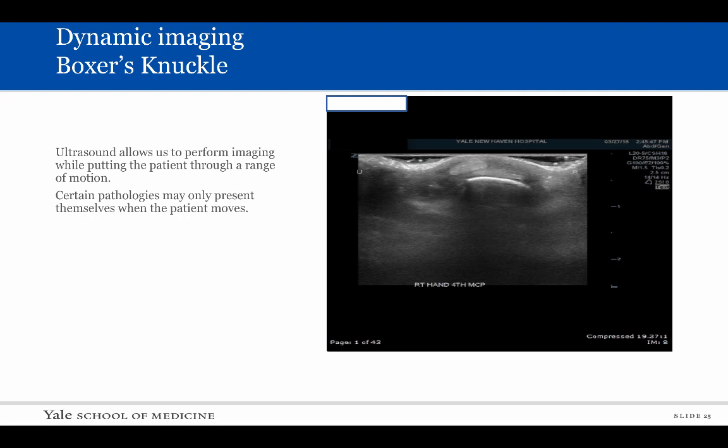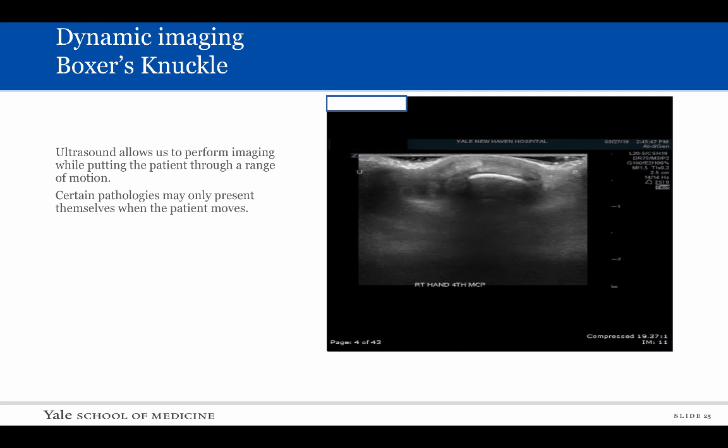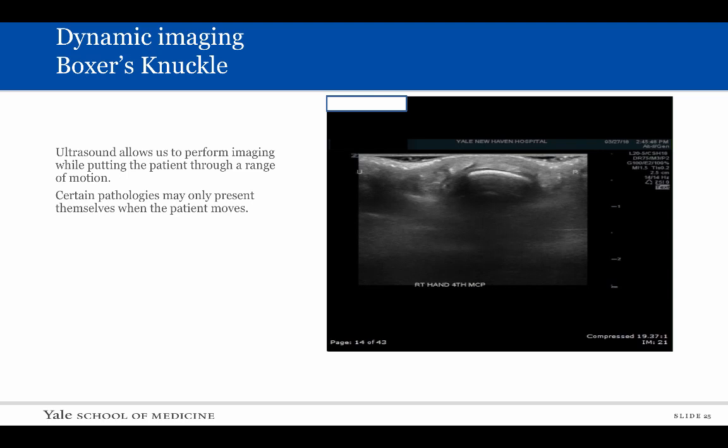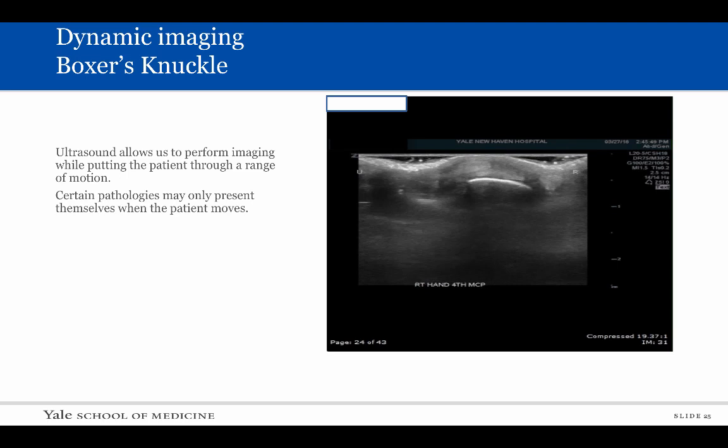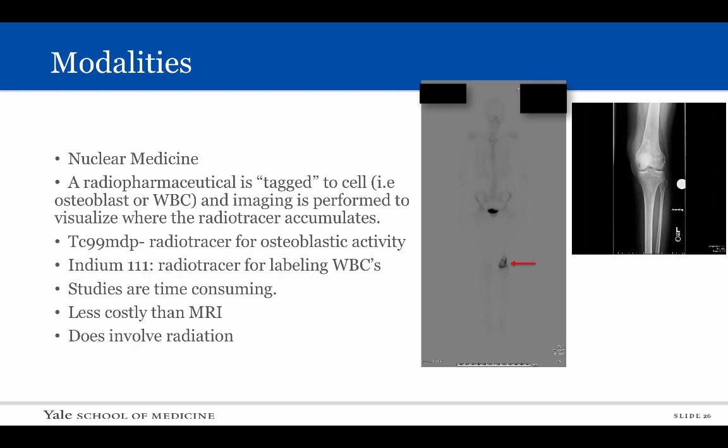This was an interesting case of a gentleman who struck the back of his hand against a concrete floor. Dynamic ultrasound imaging was performed while we flexed and extended the patient's finger. The hyperechoic tendon at the top middle of the image flips in and out of its normal position above the metacarpal. Normally, the tendon should remain positioned above the metacarpal.